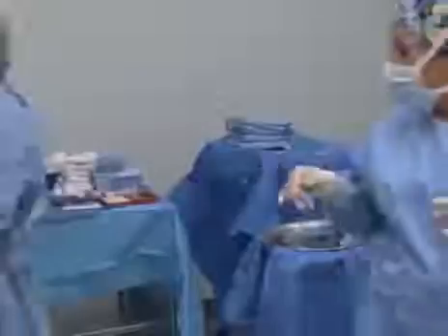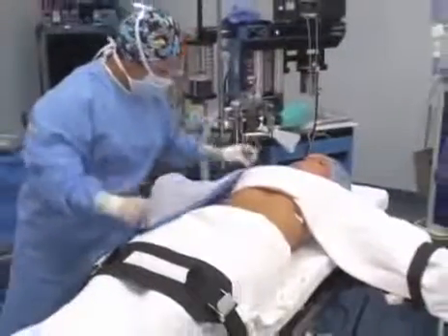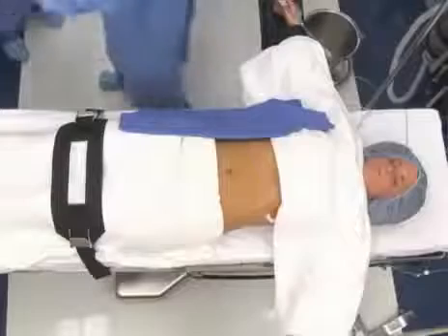The procedure for draping the abdomen is one of the most common draping techniques and may be used to drape for many surgical procedures regarding the abdominal cavity. Surgical towels made of heavy absorbent cloth are used to make a frame around the incision site. Towels are folded along one edge before positioning them on the patient.